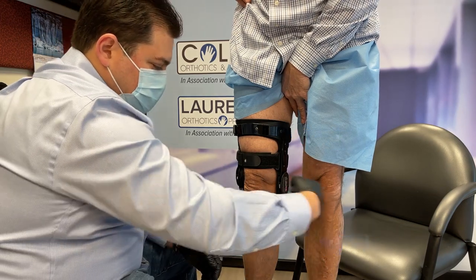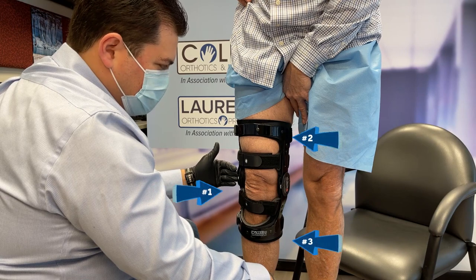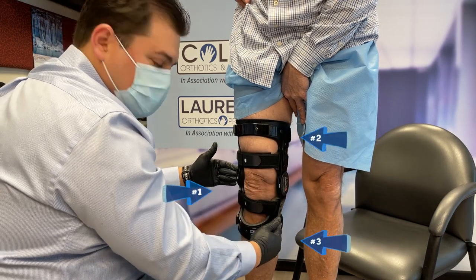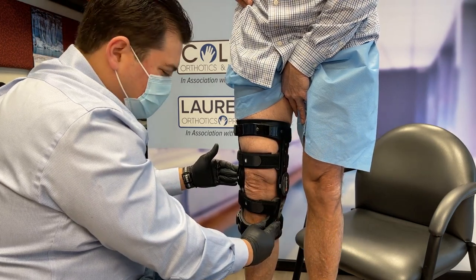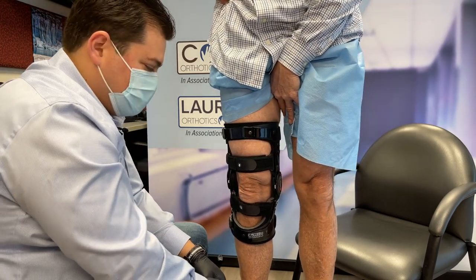The bow pulling this way is the hinge on this side, and the top and bottom are going to be fighting back against them. That's going to provide him the offload he requires for his specific pain that he's feeling today.